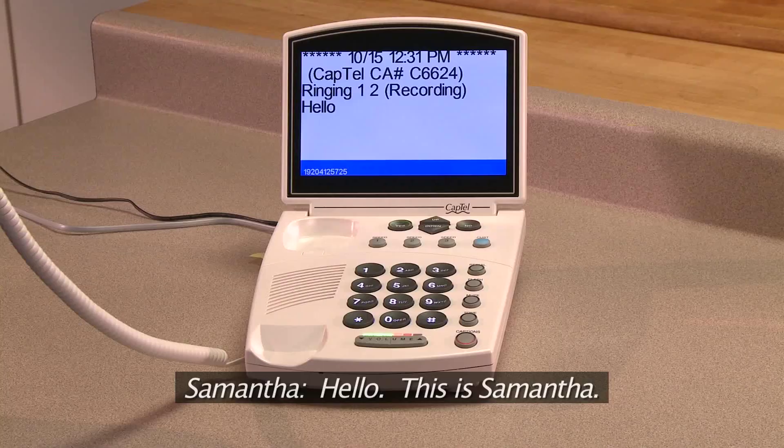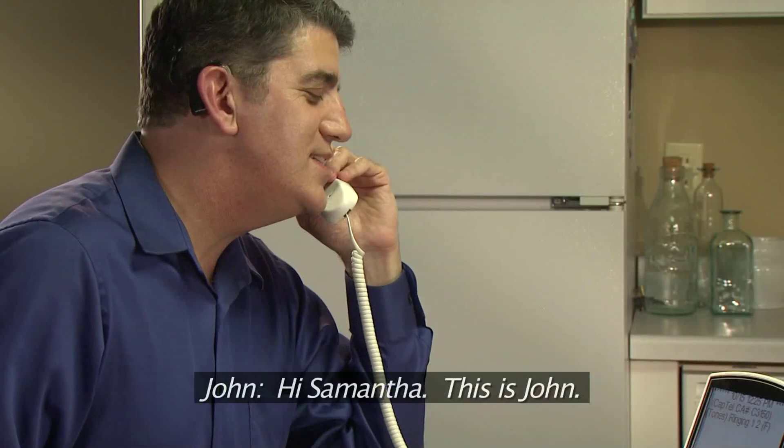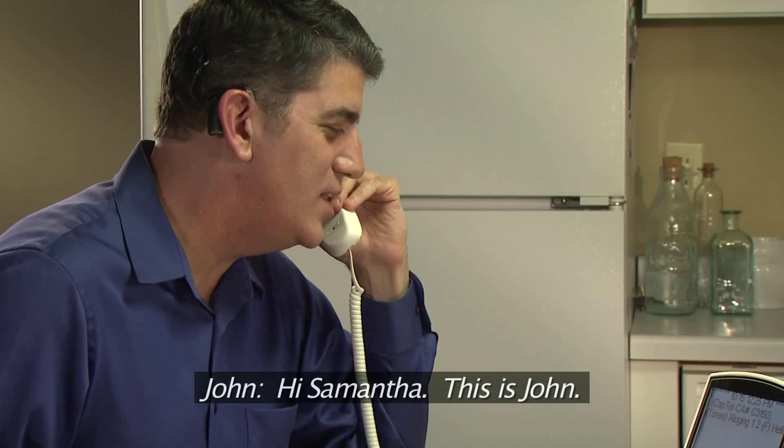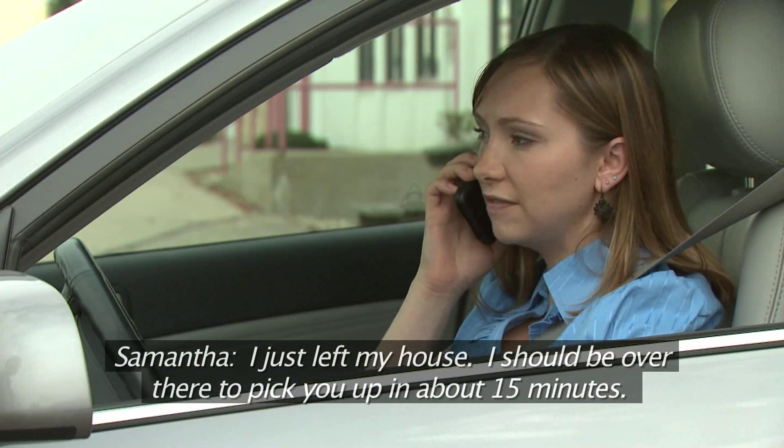Hello, this is Samantha. Hi Samantha, this is John. I just left my house. I should be over there to pick you up in about 15 minutes.